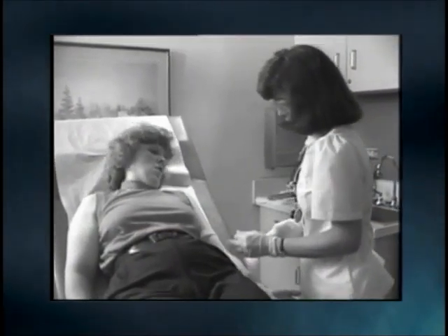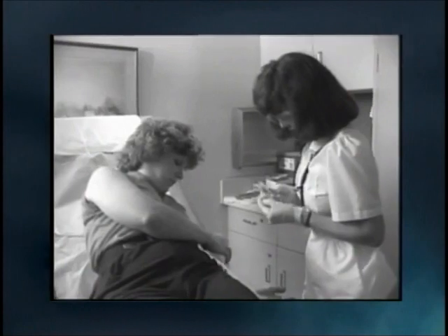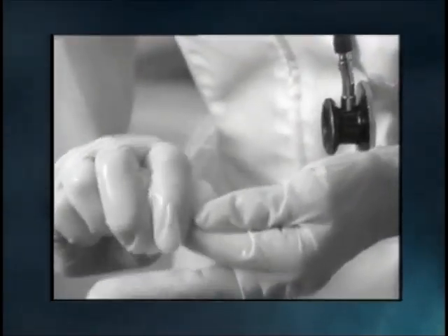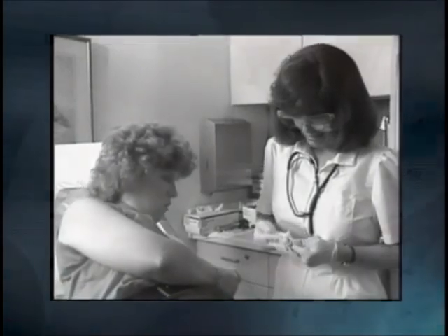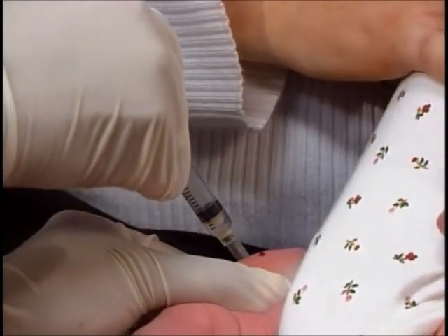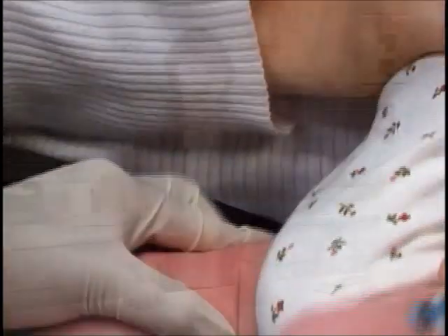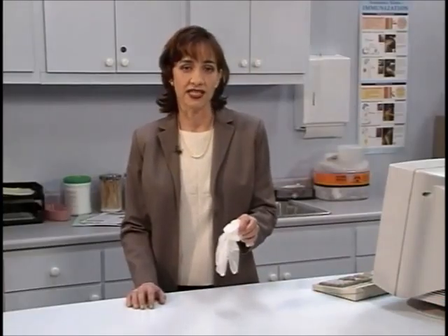Report any needle stick injury immediately to your supervisor so that it can be evaluated and officially documented and appropriate prophylactic action taken. Injections can mean coming into contact with blood, so follow universal precautions. Although gloves won't protect against needle stick injuries, many practices require gloving for immunization as a precaution. Other practices leave the decision to the personal preference of the healthcare worker.